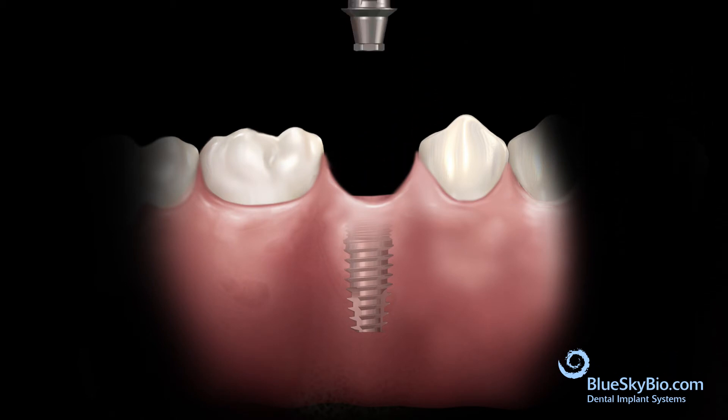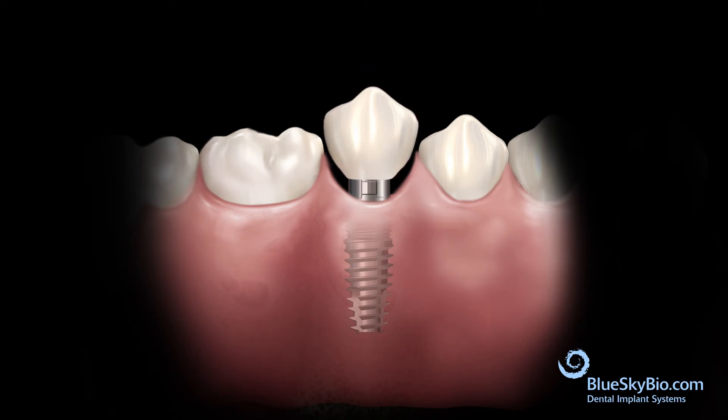Insert the abutment into the implant and tighten the screw with light finger pressure. Place the crown on the abutment and remove any interproximal and occlusal interferences.